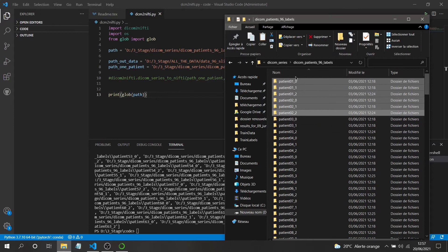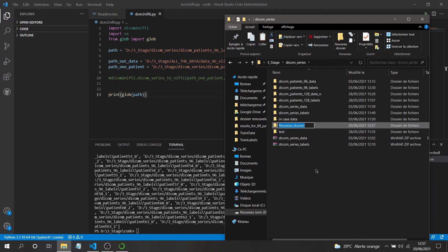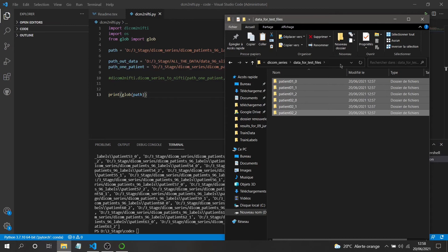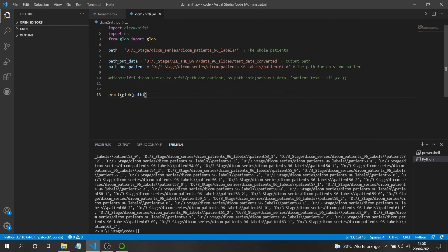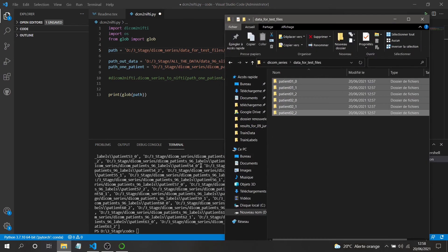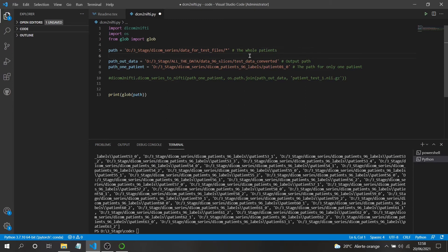I'll take only four or five patients for this demo so it doesn't take too much time in the video. I'll update the data path to this smaller folder containing only five or six patients. If I left all patients in, the conversions would take a long time. I'll clear the output and proceed.